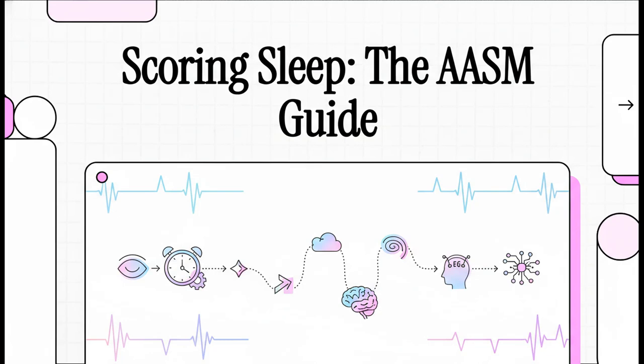All right, let's dive into the world of sleep scoring. We're going to take the super technical AASM manual and break it down step by step. Think of this as a condensed training session designed to take you on a journey from knowing basically nothing to feeling really proficient. Let's get started.